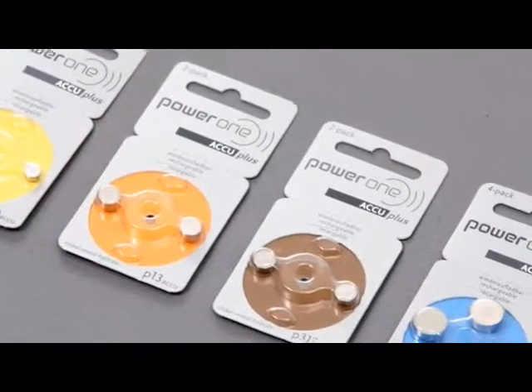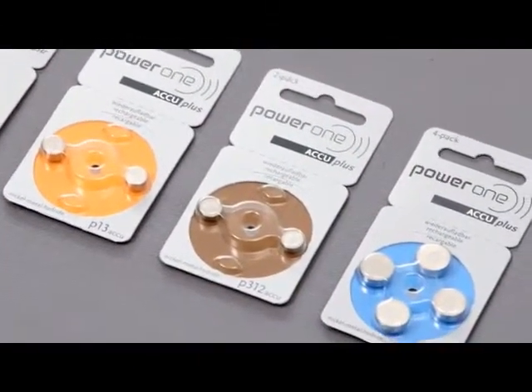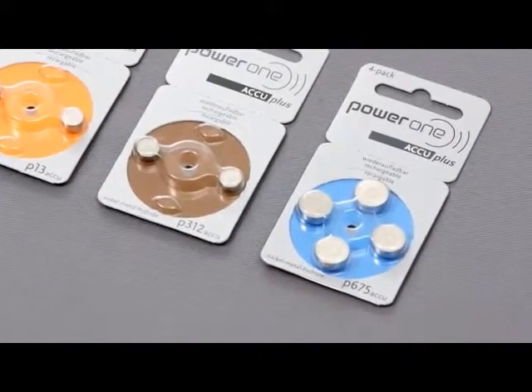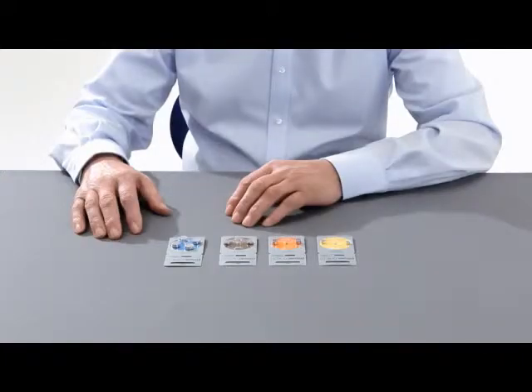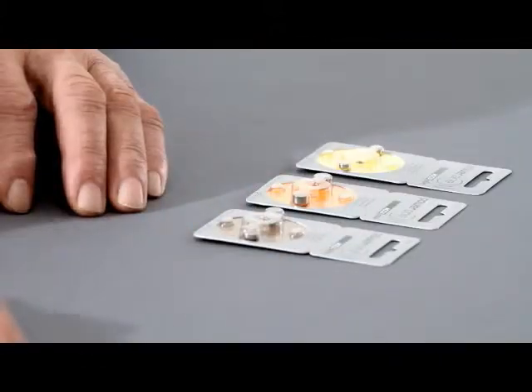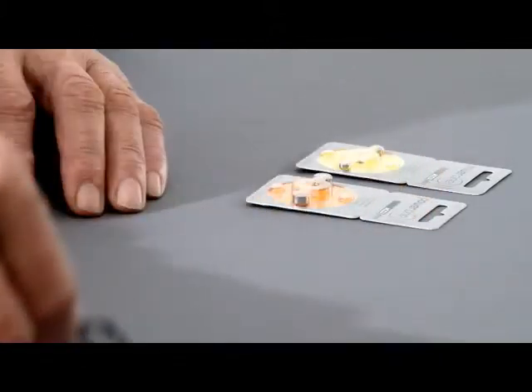The advantage? You no longer need to keep buying new batteries. You avoid battery waste and help protect the environment. Power One Accu Plus is available in all four sizes. The color of the packaging is the same as with the normal, non-rechargeable batteries.